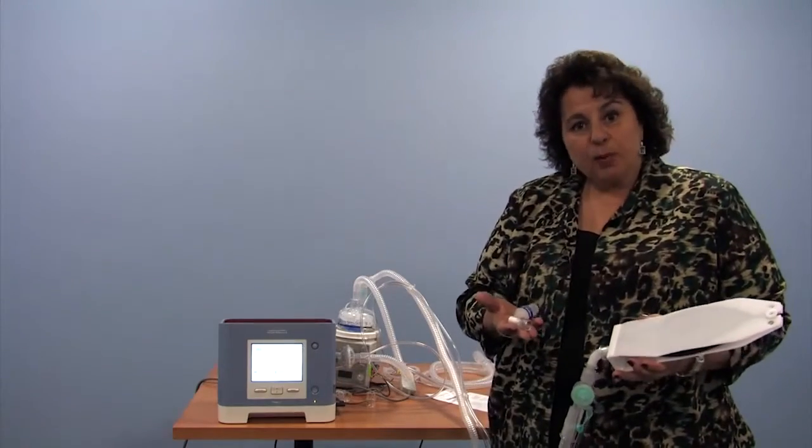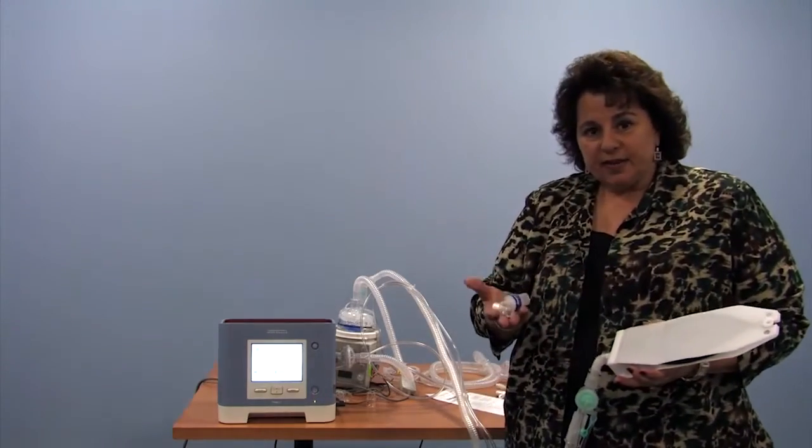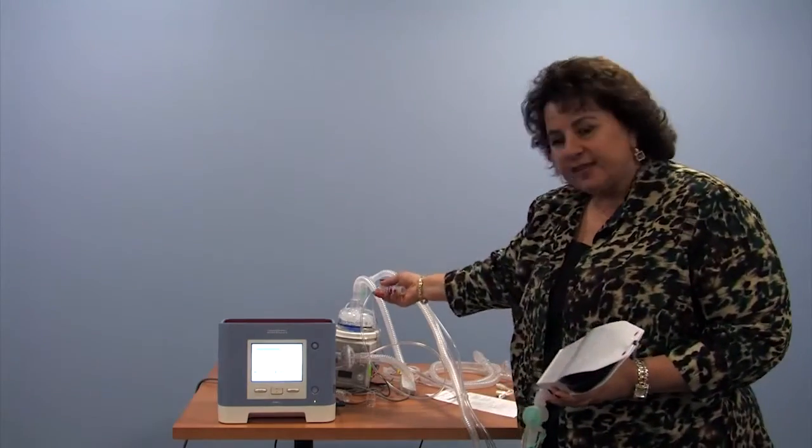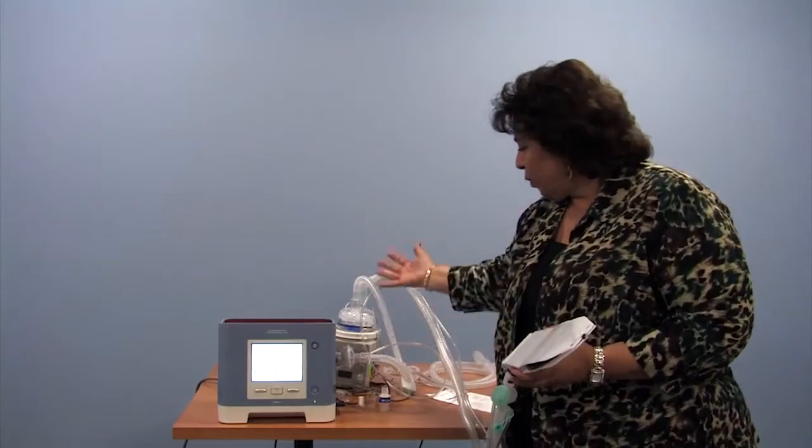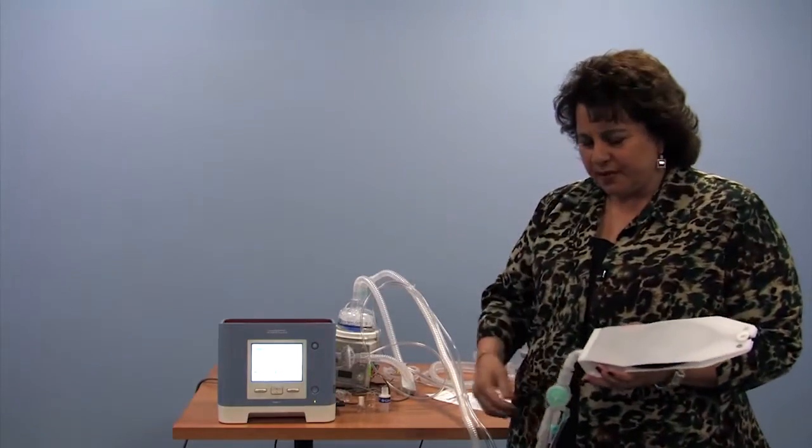When you leave the home, and we'll show you that shortly, this would be used and not obviously taking this humidifier system with you because it's rather bulky. And if you spill the water into the hoses, that would not be too fun for your child.